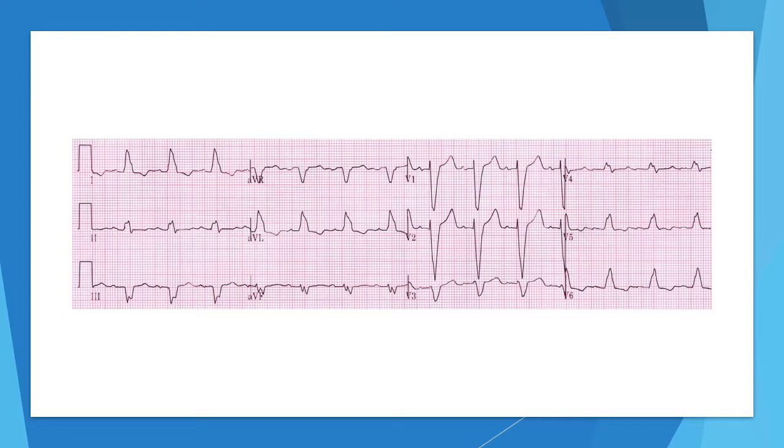And again, out of the two, these can be the uglier of the two. They typically correlate more with heart disease, especially since the left ventricle is much more affected by heart disease. And so people who develop late stage heart disease are very prone to having left bundles and can have very ugly ECGs.